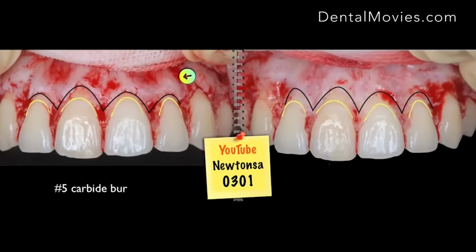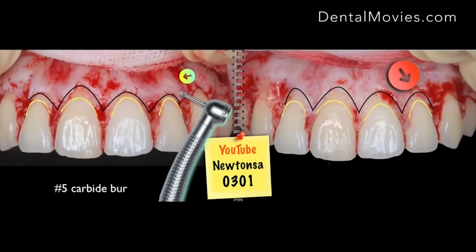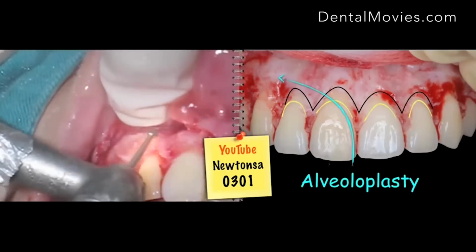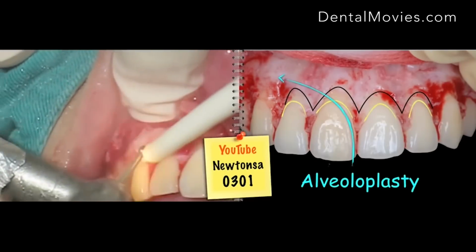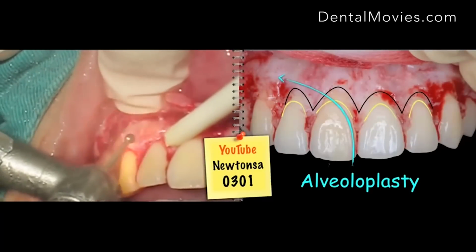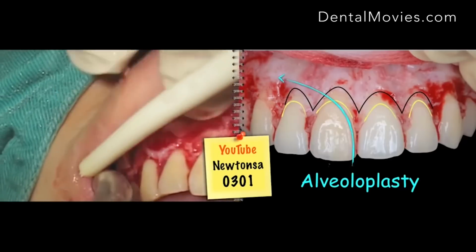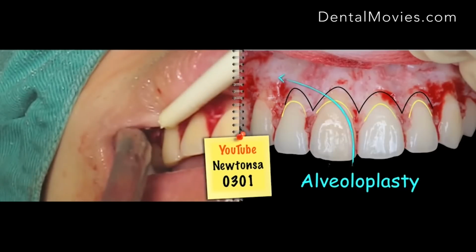So you can also use this called number 5 carbide burr. I love this number 5 carbide burr. It just smooths that out. It will take you about 2 minutes. Okay, so that is the way we contour. We trim the bone, alveoloplasty. We trim the bone around here. We also trim the bone above the CEJ.